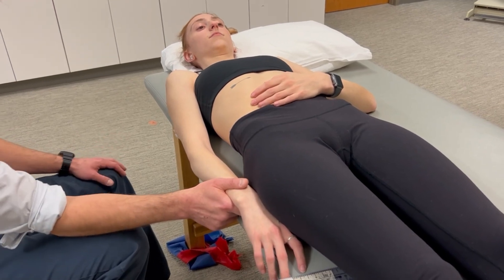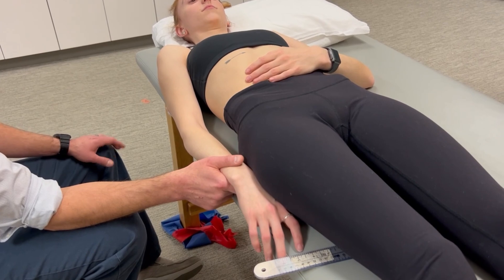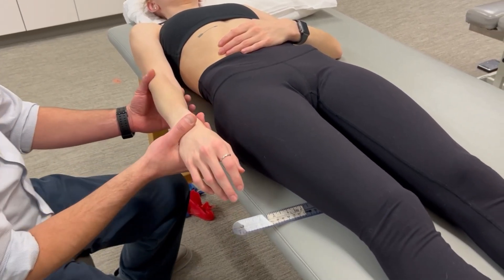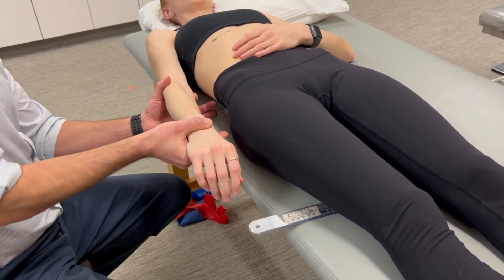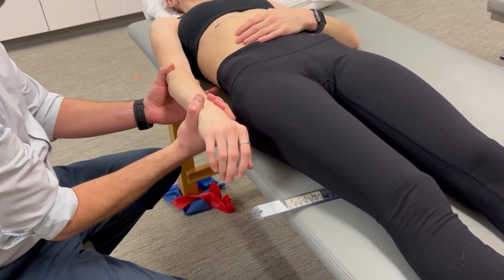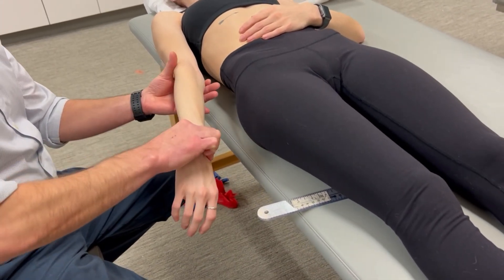With the biceps brachii muscle length test, we're going to measure the shoulder — we're going to move the shoulder last and take our measurement at that indicator joint. Since the biceps brachii is a supinator of the forearm, we're going to maximally pronate. Biceps is also an elbow flexor, so we're going to maximally extend the elbow.